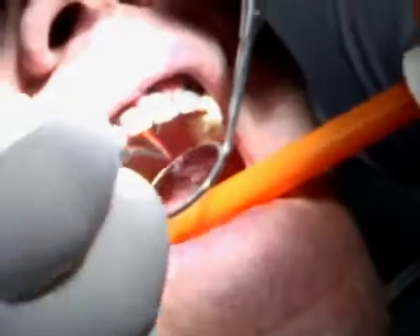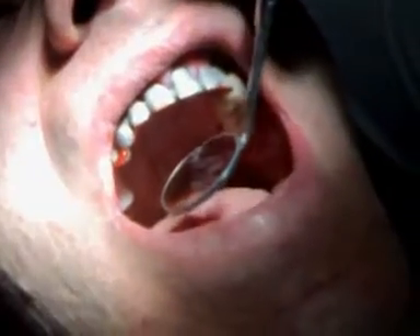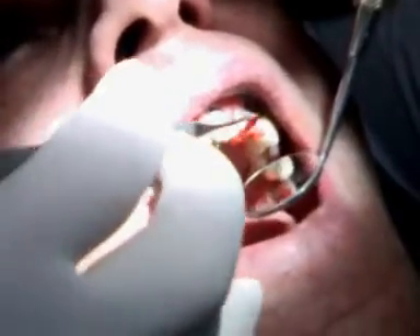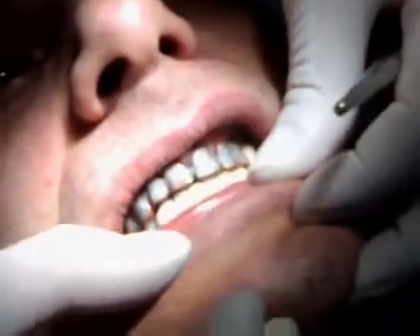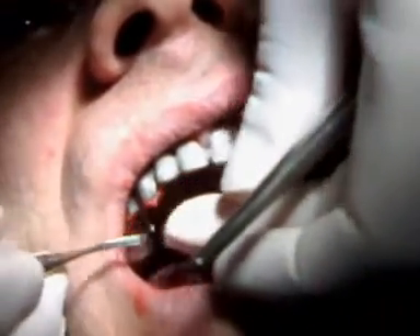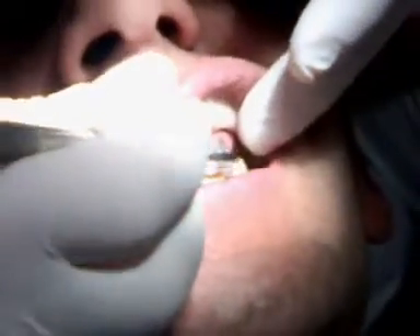Now we're going with the Duralay to establish centric occlusion. We will be re-articulating this framework for the correct position on our semi-adjustable articulator. Now he's closing for it — it looks good.